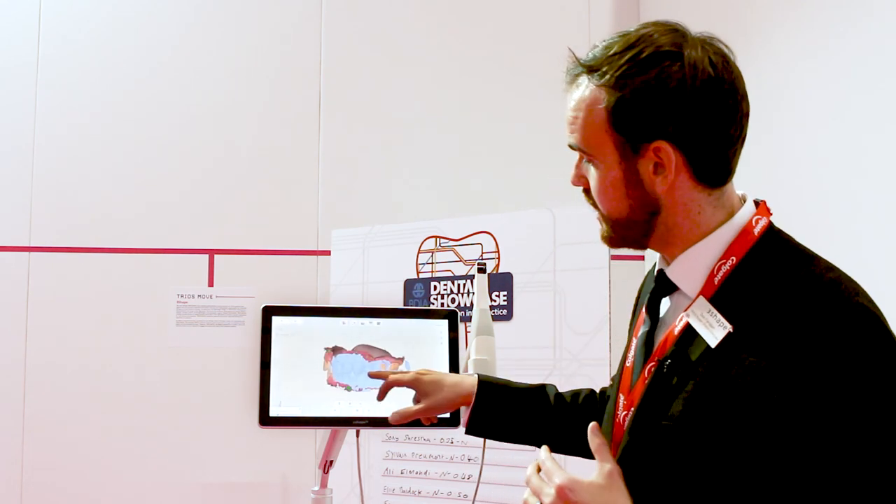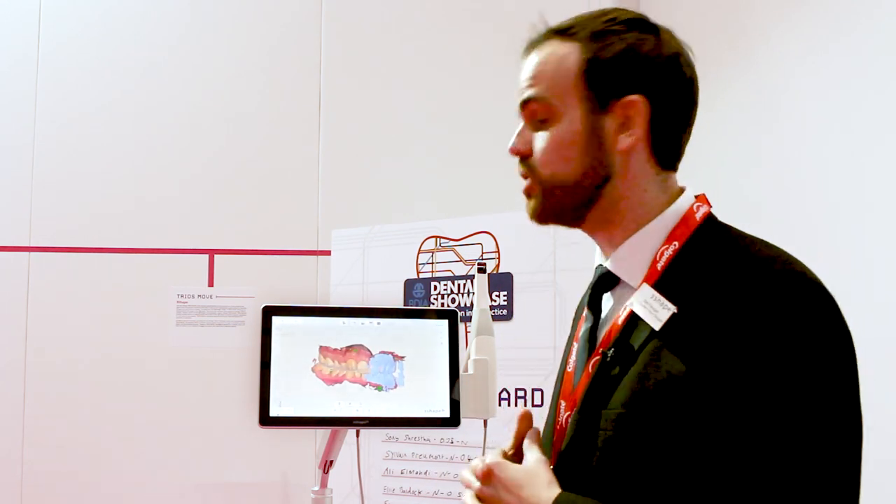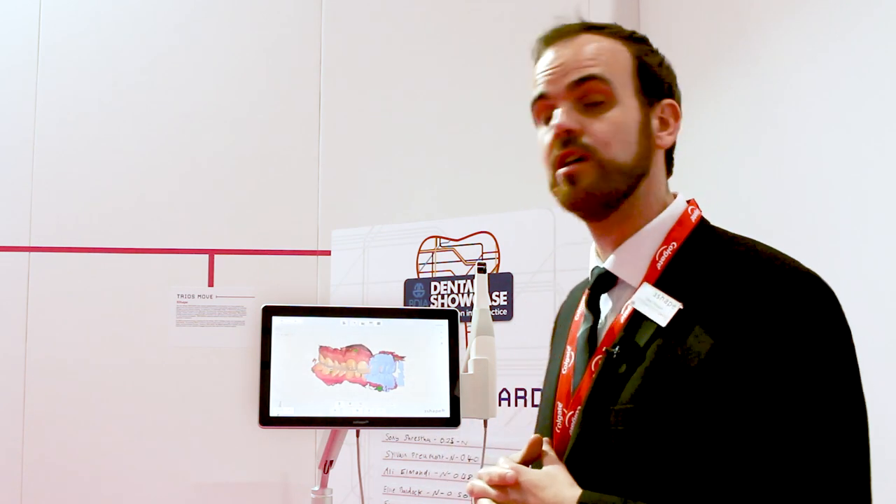And that's all there is to it. It is very simple and intuitive to use, but it is changing the way we look at dentistry. More importantly, it's getting the patient involved. As well as viewing this scan in clinic, we have the ability to send a patient their scan via an app. We are changing the world of dentistry — so let's change dentistry together. Thank you.